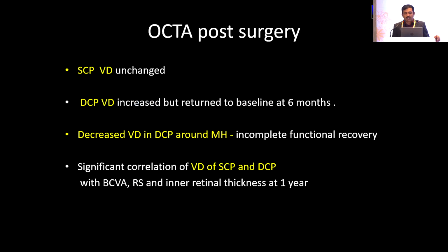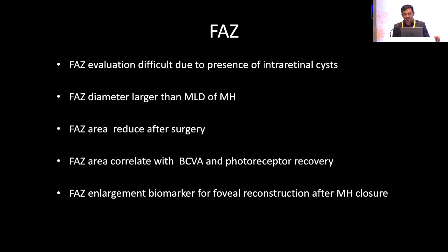Coming on to the OCTA, usually the vessel density in the superficial capillary plexus is unchanged. In the deep capillary plexus it is increased but returns to baseline at 6 months. Please look at the decreased vessel density in the deep capillary plexus around the macular hole, which could be contributing to the incomplete visual recovery. So, vessel density in the superficial capillary plexus and deep capillary plexus does correlate with visual acuity, the retinal sensitivity, and retinal thickness at 1 year.